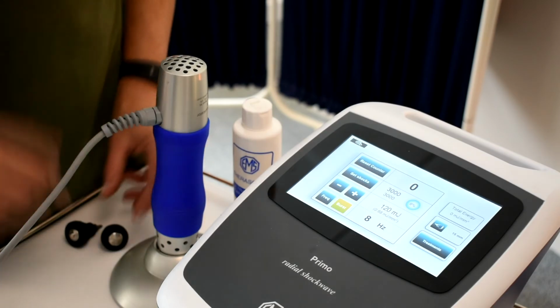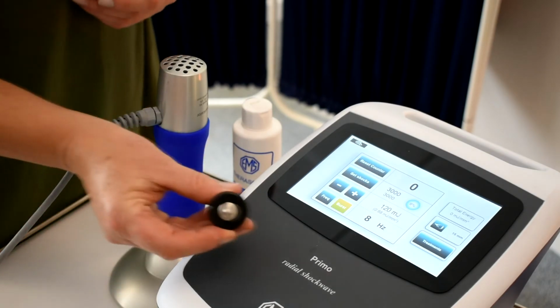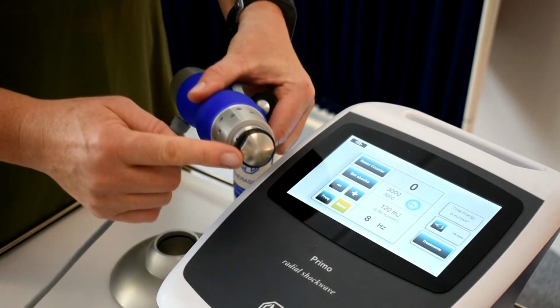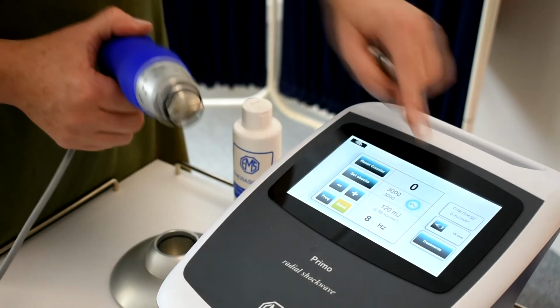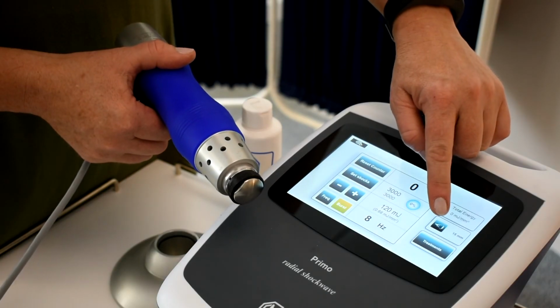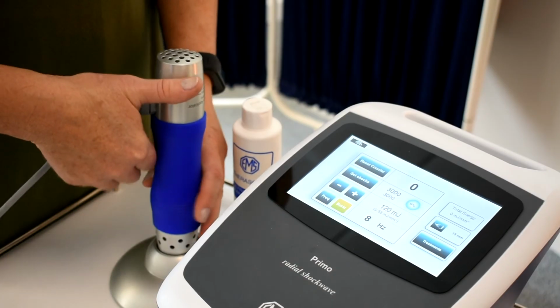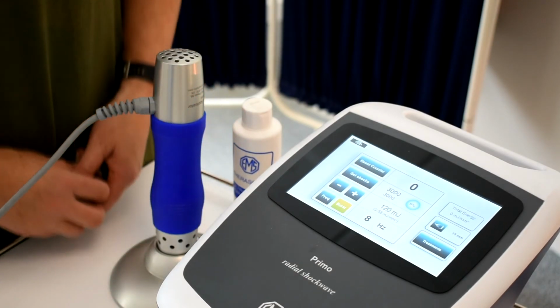It comes complete with 3 applicator tips, 6mm, 15mm and 25mm. And the tip that is being used can be selected here. Selecting this, the unit will register how many shocks each tip has completed.